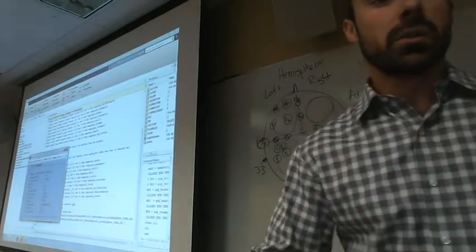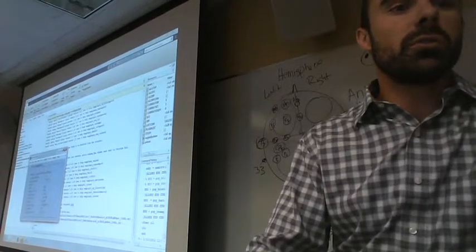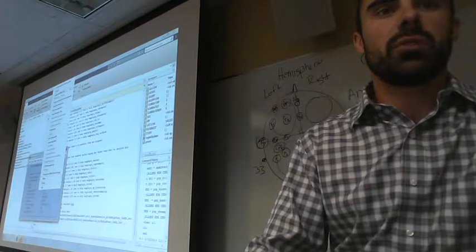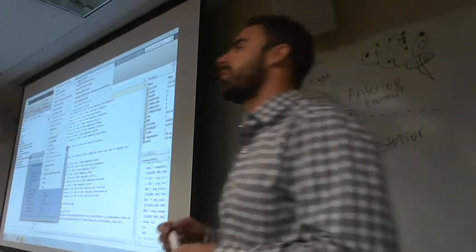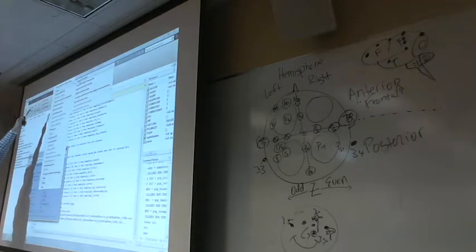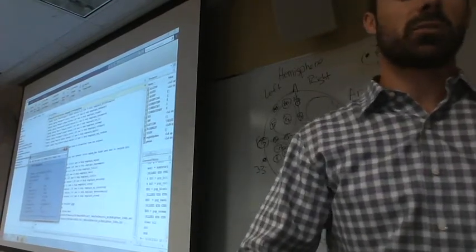So what we're going to do first is go to EEG Lab. We are going to go to Events List. We're going to do Create Events List. All right, so this stuff is all really intuitive. If you're asking yourself, oh, what did you do? How did he get here? Ask yourself, well, what's the goal? Well, the goal is to create an events list. So you might as well go to the field that says Event List and then select the option that says Create One. Okay? So I hit that button, and it's going to ask me some questions.